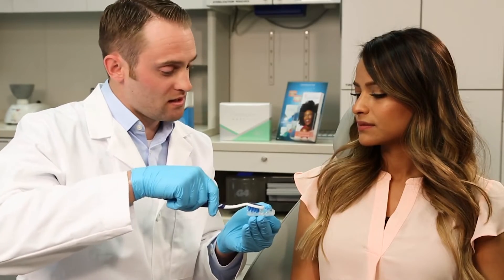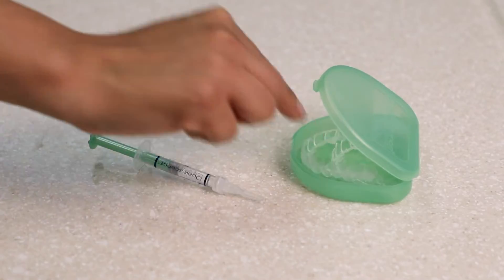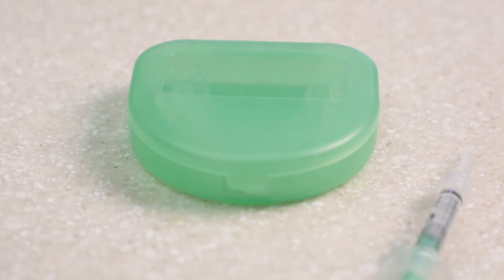Clean the tray with a soft toothbrush and water. Store trays in the case provided by your dental office.